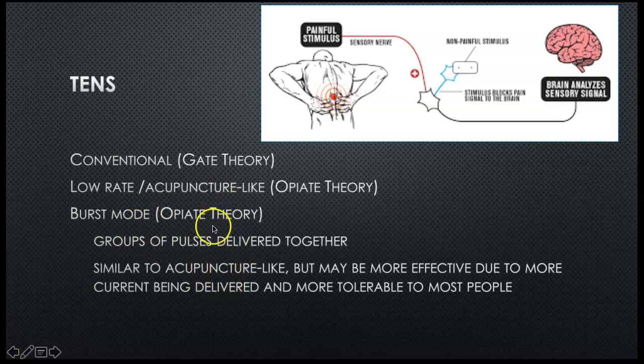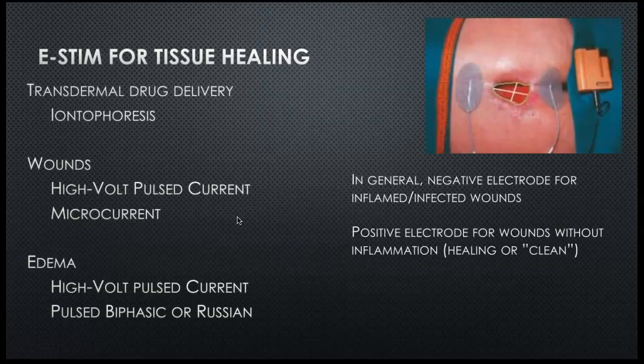It really probably feels very similar to acupuncture. So it's just, again, patient preference. But both of those, they're a little bit more jabby. And so they're working on that opiate theory, like you're sort of irritating that area on purpose and it releases opiates to calm it down.